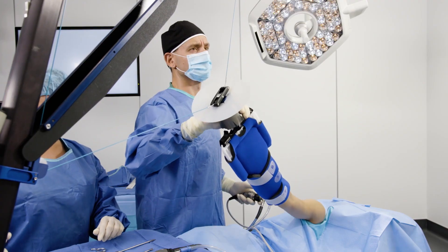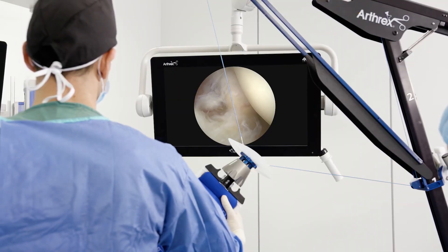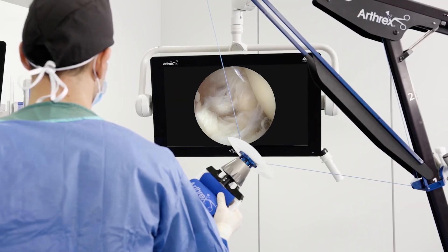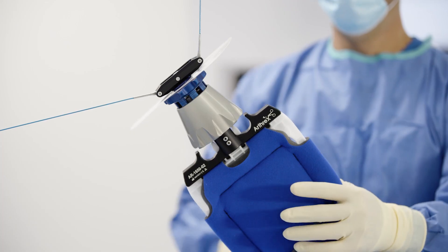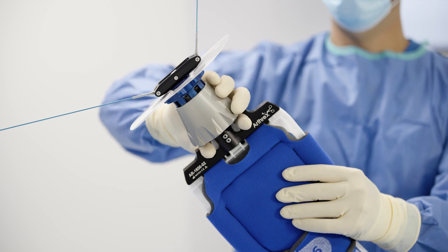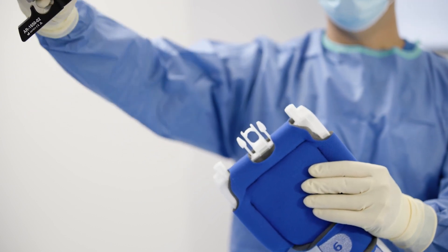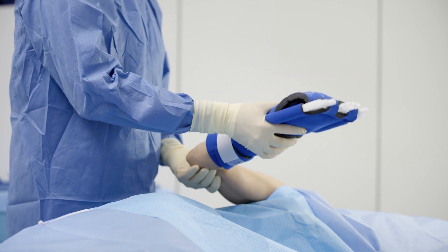Stable arm abduction and internal and external rotation adjustments can be altered on the fly in a sterile manner to produce unparalleled arthroscopic visualization without outside help. Taking the arm out of suspension intraoperatively is achieved simply by depressing the tabs holding the arm sleeve to the connector, to easily and quickly check the range of motion or access pathology.